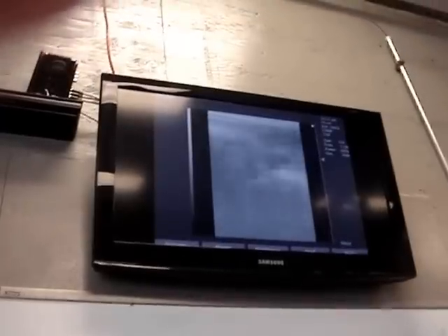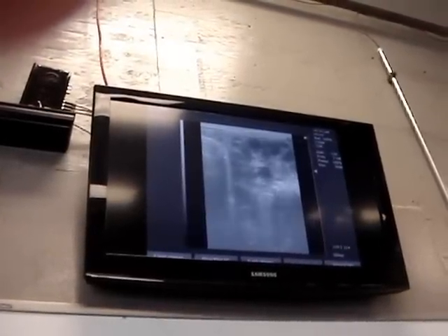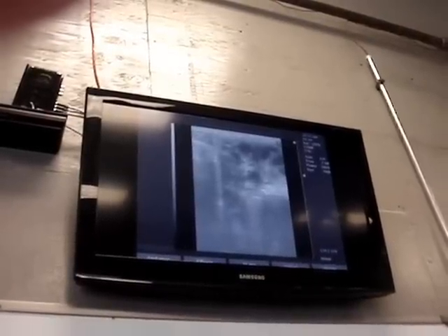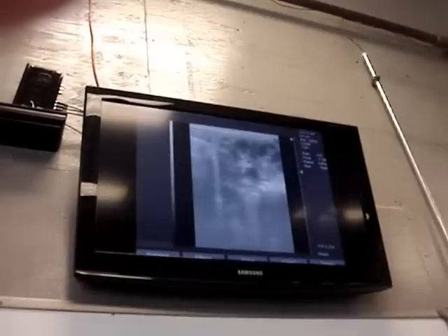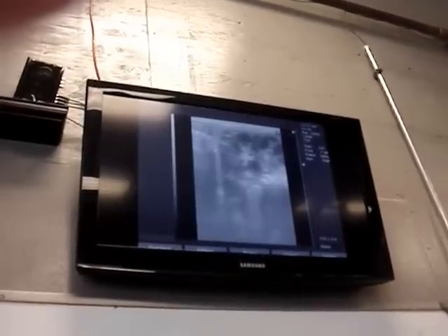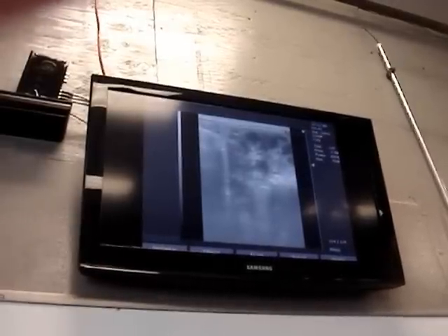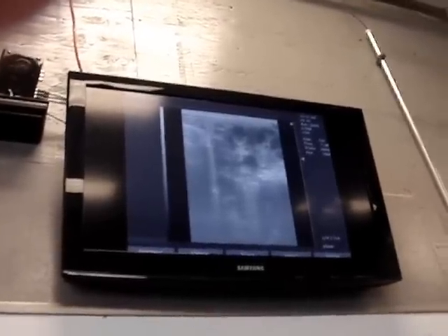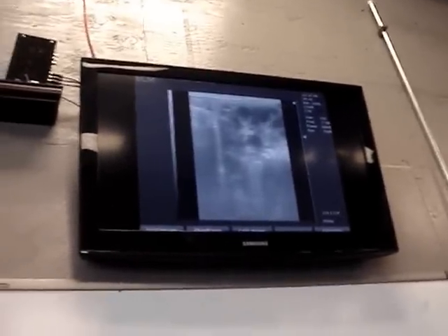So I can go up her left uterine horn, and that's her left ovary, which is what's at the end of the uterine horn, right? So all of these little black circles that you guys can see, those are all follicles, exactly. Each and every single one of those has a little egg in them. And as one of them gets chosen to go on and get bigger, and she goes into heat, one of those will be the one that actually ovulates and will be ready to be there when semen needs to be inseminated.